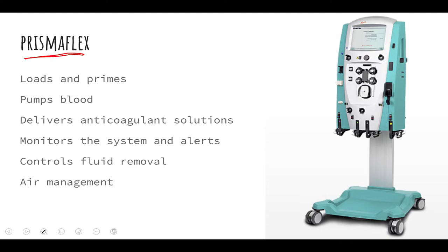In this video we're going to talk about the Prismaflex — the machine that is mostly used to carry out CRRT. The Prismaflex does many things for us: it loads and primes the pump with blood, it pumps the blood to and from the patient, and it delivers anticoagulant solutions while the blood is running through the machine. The need for anticoagulant is to prevent clots, since every time you're moving blood outside of the body there's a high risk of clotting. The Prismaflex device also monitors the system and alerts us — if there are any kinks or anything out of the ordinary, it has a good alert system.